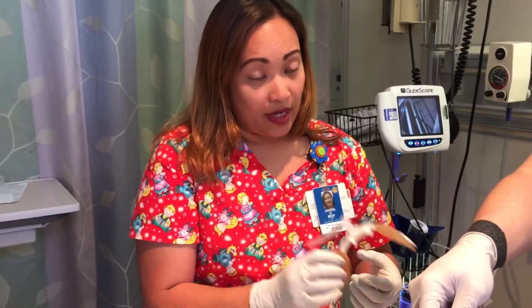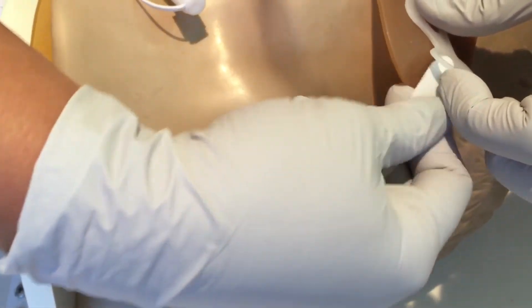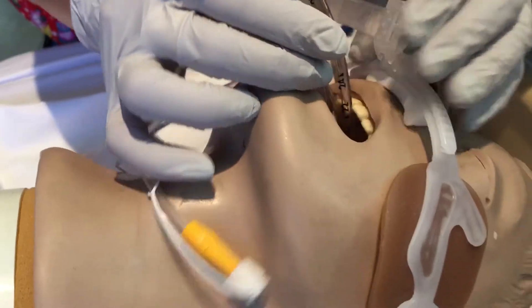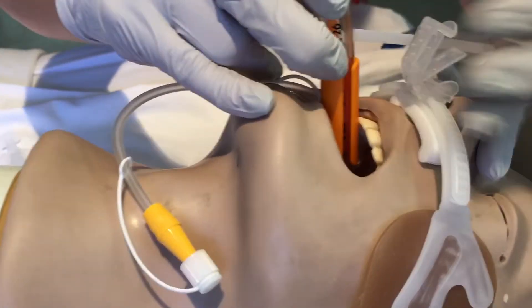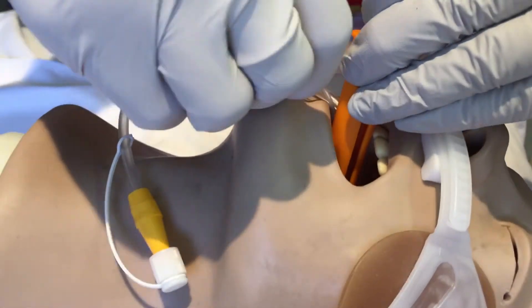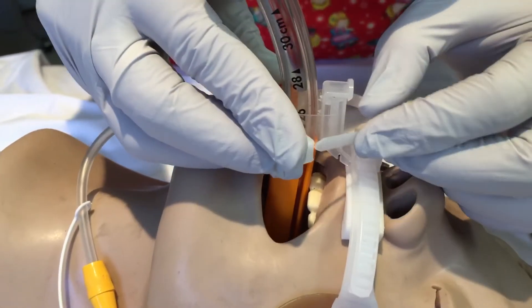Now while somebody's holding your tube, grab your Hollister and stick it on the patient's face, then wrap it around the head under the ear. This is the strap — secure the proper tightness. And if the patient requires a bite block because the patient has teeth, then grab a bite block and place it on the tube. Make sure that you won't lose the placement of the tube. Secure the Hollister first — sticky and snap it — and then grab your bite block and tie it around the Hollister.